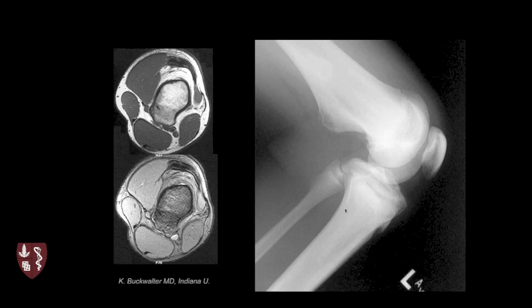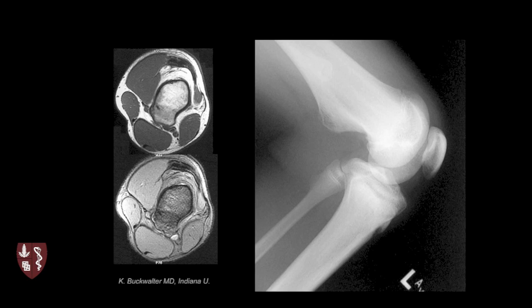Bursa formation is one complication; vascular compromise is another. Here's an example of a broad-based sessile osteochondroma on the posterior femur — this patient may actually have multiple hereditary exostoses given a small lesion off the fibula. The MRI shows continuity with the medullary space and impingement on the femoral vessels posteriorly. This young patient presented with claudication-type symptoms from mechanical effect on the superficial femoral artery. Complications include bursa formation, vascular compromise, nerve impingement, and local pain.